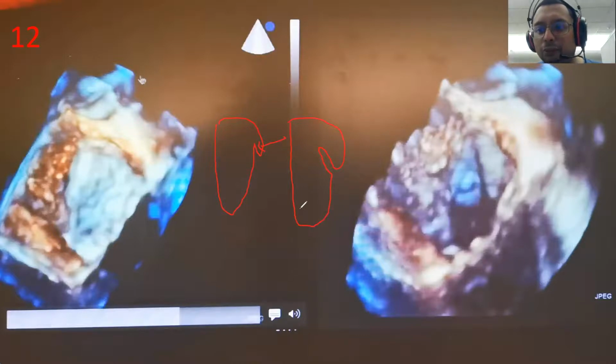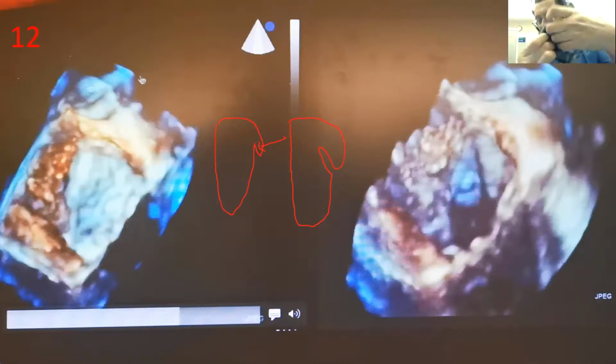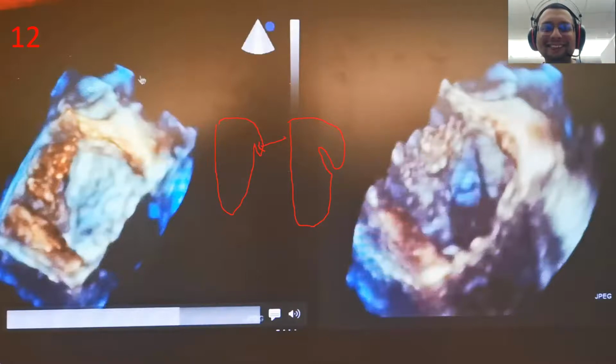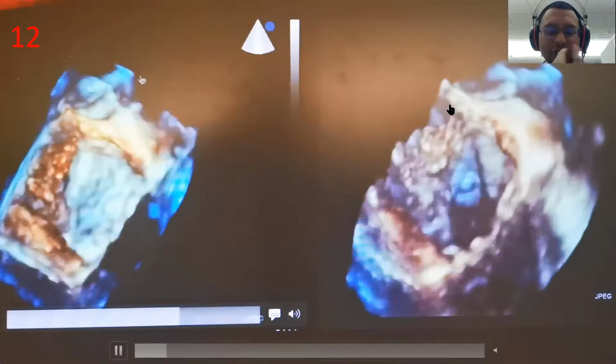So what they do is they just put it back. What will happen? Nothing happened. They just put that back inside. They pull it in, then they just push it back, like your socks, right? Like you see, this is my glove. It gets pulled in, inverted, pulled like this. That's what you see. So what does the surgeon do? The surgeon just pushes it back. So it doesn't cause anything. So next time you see that, don't panic. It's not a tumor or anything.